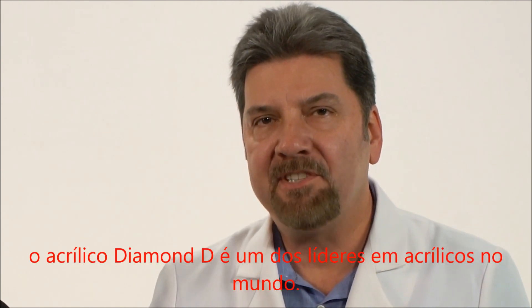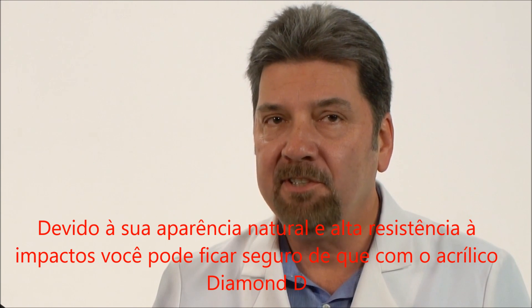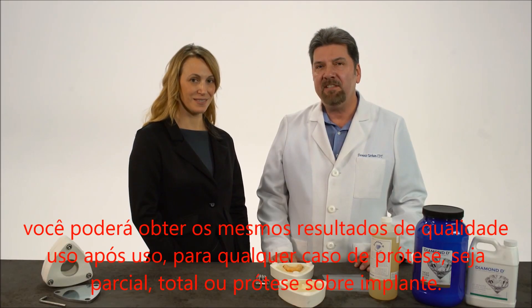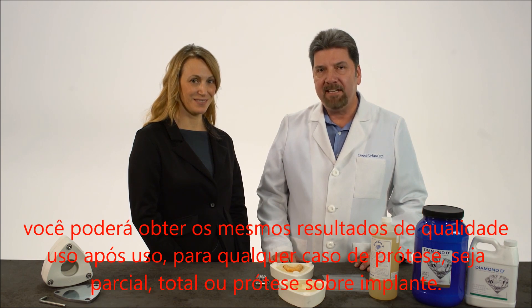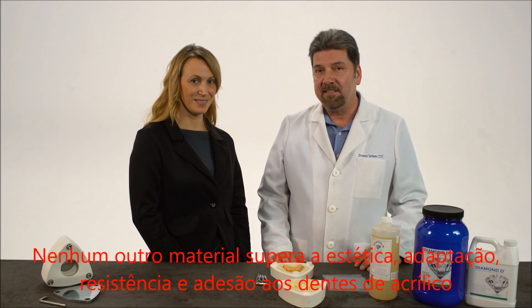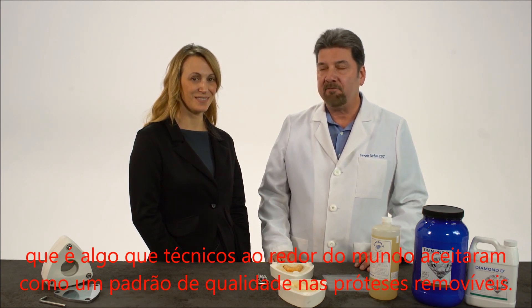Diamond D Denture Acrylic is one of the leaders in acrylic and dental technology around the world. Because of its natural look and high impact strength, you can rest assured that with Diamond D Acrylic, you can achieve the same quality results time after time for any type of denture case, whether it be a partial, a full denture, or an implant retained denture. The unsurpassed aesthetics, fit, strength, and bond to denture teeth is something that technicians around the world have accepted as a quality standard on removals.